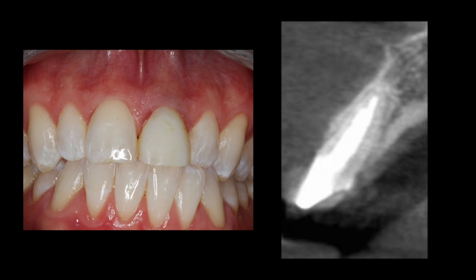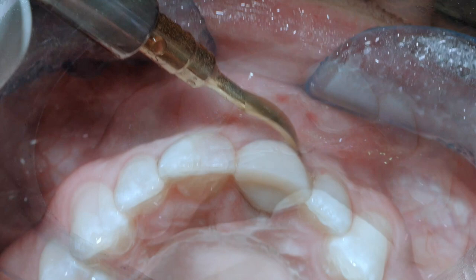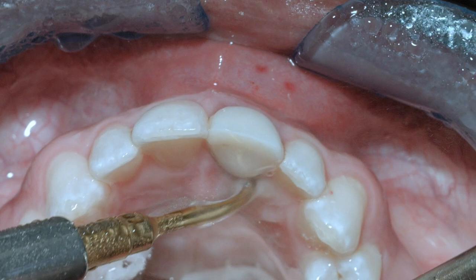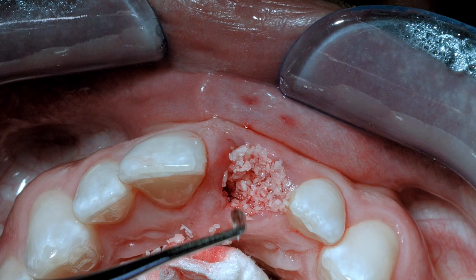I'm going to use a flapless technique for extraction. I prefer piezo-ultrasonic instrumentation down into the PDL space to make it easy to luxate the tooth with a forcep for atraumatic removal, maintaining the buccal plate, which is easily damaged without an atraumatic approach. I'll use the piezo-ultrasonic instrument patiently, getting all the way into the depth of the PDL. A throat pack is in place because there is very little tooth structure remaining — if the crown and post were to come off, we don't want the patient to swallow it. After that piezo-instrumentation, the root is easily luxated and removed, the buccal plate is intact, and then we slowly and sequentially pack the bone material in place.